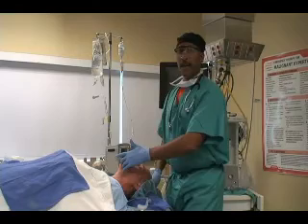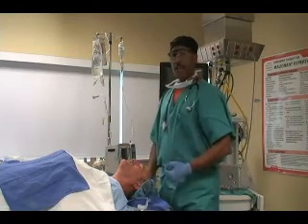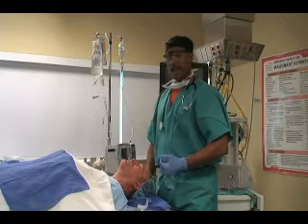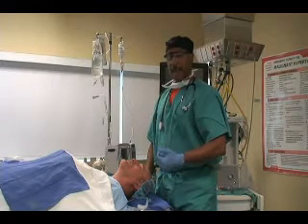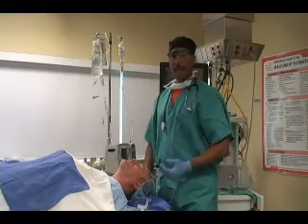So, in this basic airway management vignette, we've covered head position, application of the mask, correct placement of the mask on the patient's face, ventilation, and managing an obstructed airway.